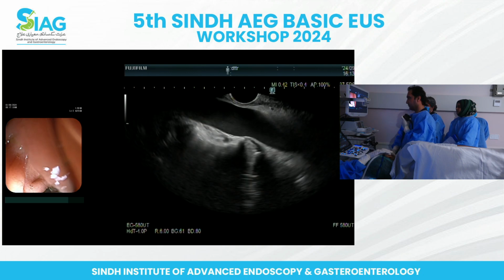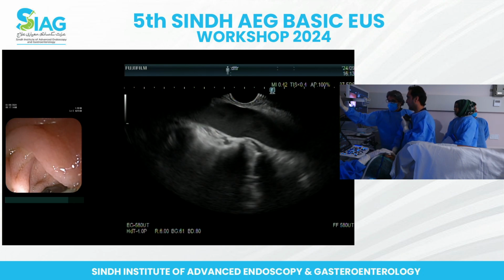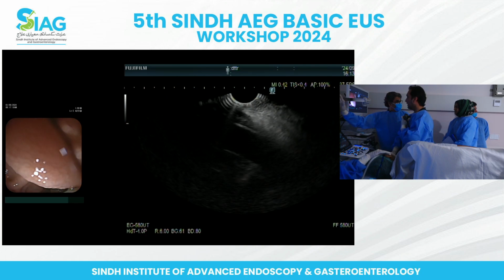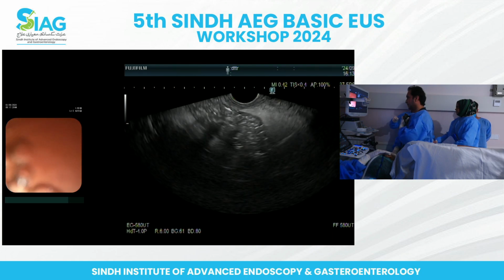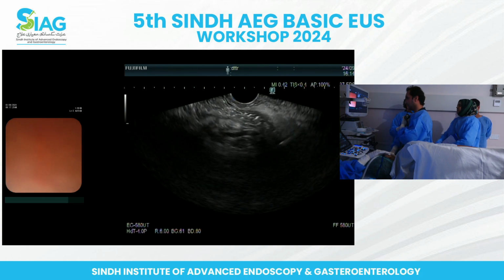Very nice. So when you see this, then here somewhere is the pancreatic head. And whenever something is on this side of the screen, you have to pull out. And when something is on this side of the screen, you have to push. Yeah?